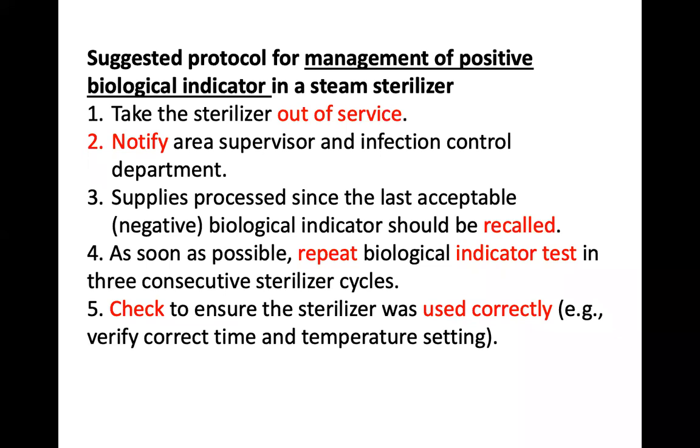Two, if you are the one running this gadget, notify the area supervisor and the infection control department immediately. Three, and very, very important, all items that were processed since the last acceptable biological indicator, since the last negative biological indicator, should be recalled. Okay, let me explain that. If you are doing this sterilization process this morning, today is Monday, you carried out this process 11 a.m. and you get a positive biological indicator at noon, 12 midday. When the process ends at midday, you get a positive biological indicator.